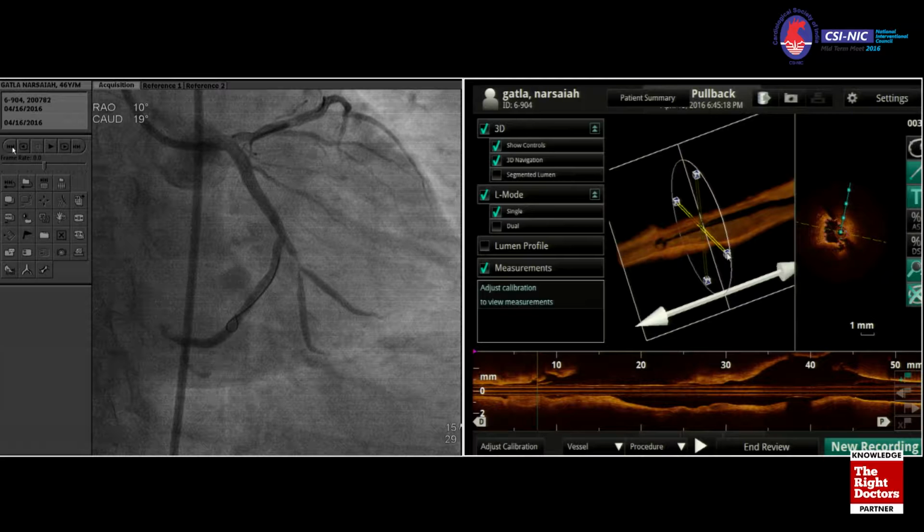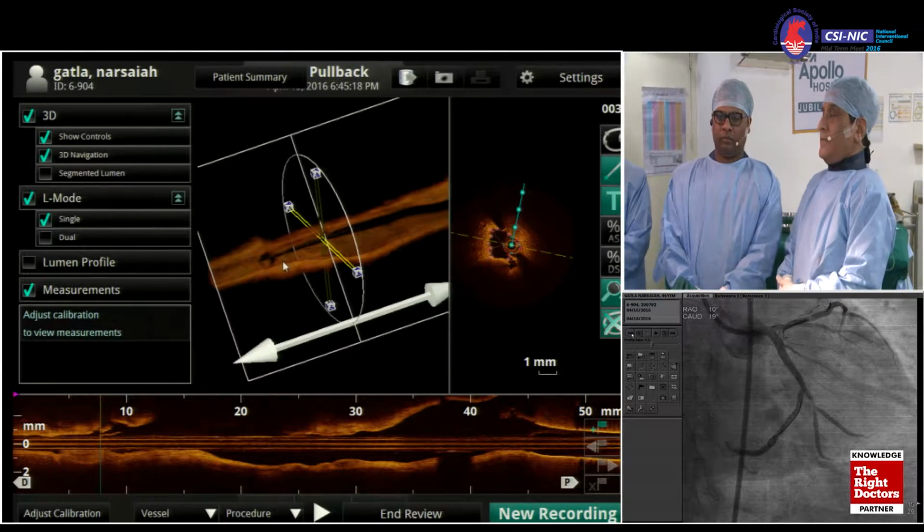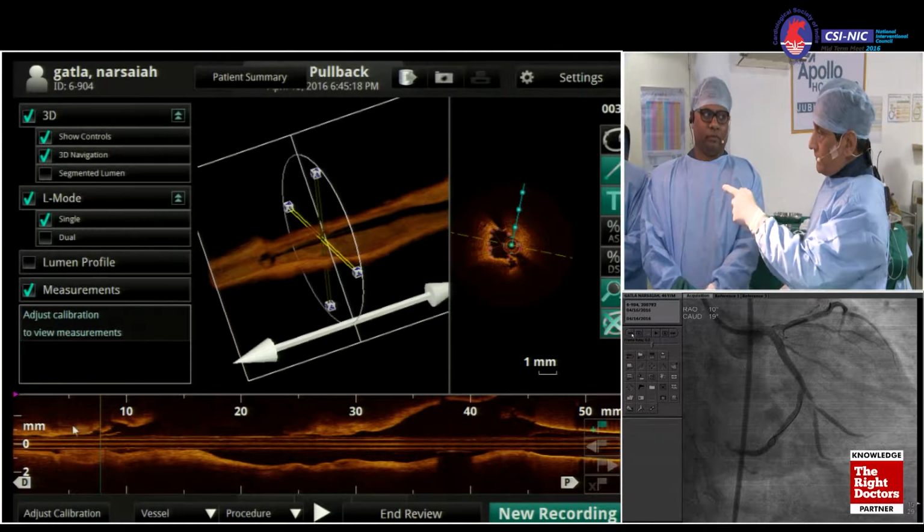We did the near-infrared spectroscopy also, the yellow, and it basically showed that it's soft plaque. If you have soft plaque, then you have more chance of side branch closure because of plaque shift if it is on the opposite wall, and less if it is a calcific lesion. It was a very interesting observation which is just coming out.